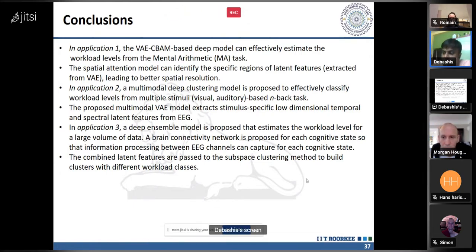In the ERP case, I actually average the trial-wise data in the time-locked event. In that case, the trial-wise noise has been eliminated. In other cases, it can also be defined based on trials with very much noise, or where the response accuracy is not so good. So we can exclude those trials also.